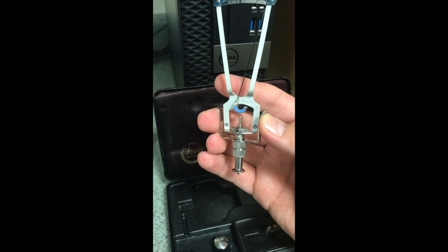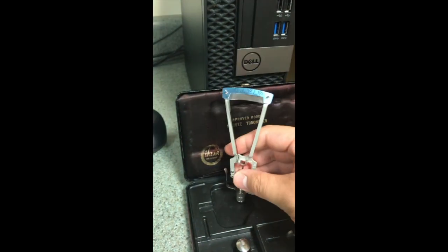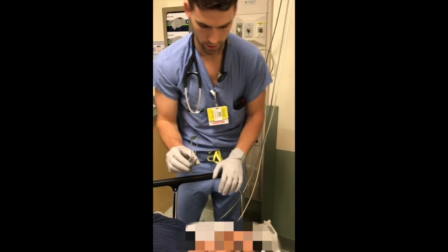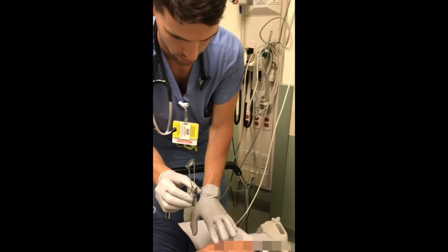So we'll go actually measure the intraocular pressure. We're going to use a Schiotz tonometer to check intraocular pressure in a patient with bilateral eye pain and a history of glaucoma.